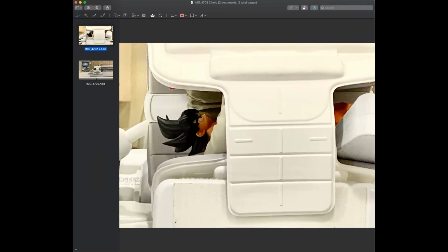So in order to be able to image its brain, we had to use a sequence which is called ZTE, a zero echo time sequence. And the idea in that sequence is that you actually turn the gradient on, and then you apply a very short RF, which will have a high bandwidth that will cover the entire volume. And then you switch immediately from transmit to receive, and then you receive on a radial line.